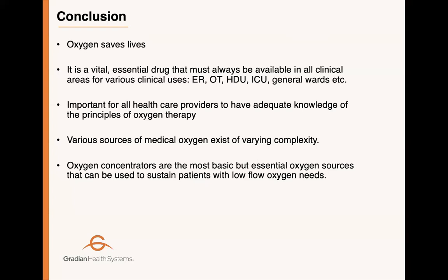It is important for healthcare providers to have adequate knowledge of the principles of oxygen therapy. Various sources of medical oxygen exist with varying complexity, and oxygen concentrators are the most basic but essential oxygen sources that can be used to sustain patients with low oxygen needs.